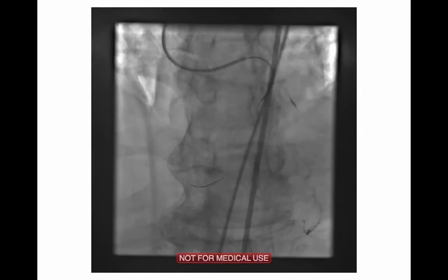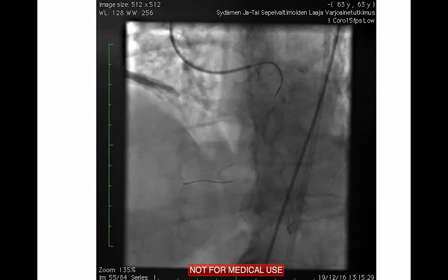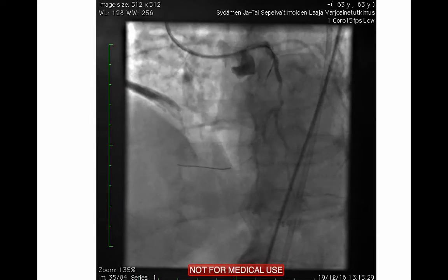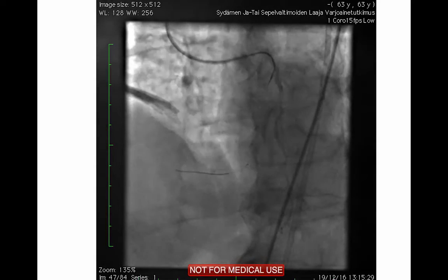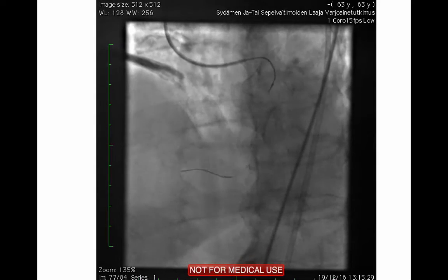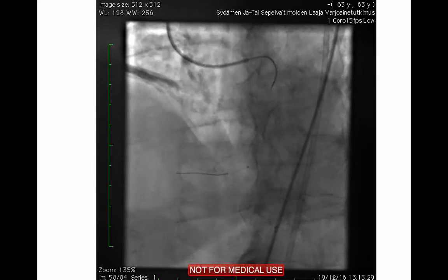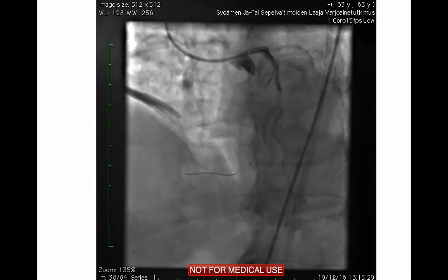This is not so close, so I have to do it again. Now we are closer, but it's still under the right branch. Great, and it looks like you have an epicardial collateral, but obviously you prefer to have the septal whenever you can, right? Even if it's a CC0 septal, it looks like you're very close to crossing that. Yes.